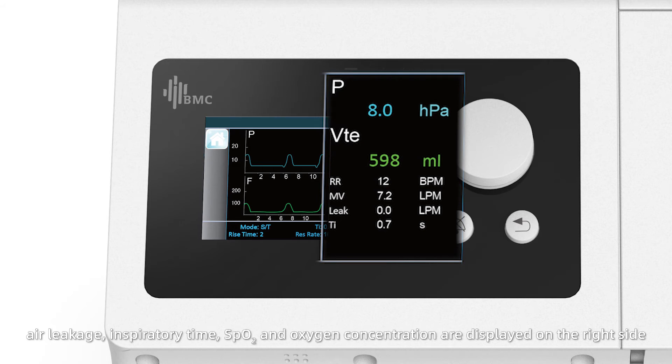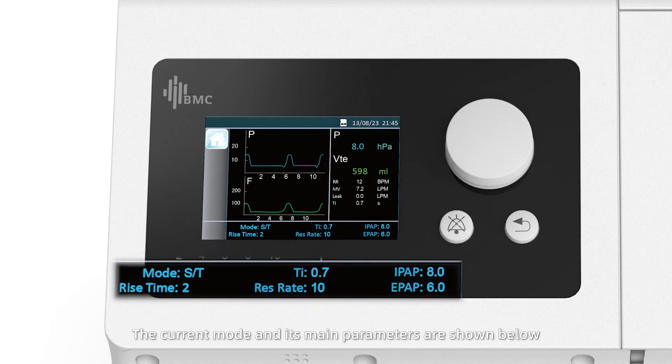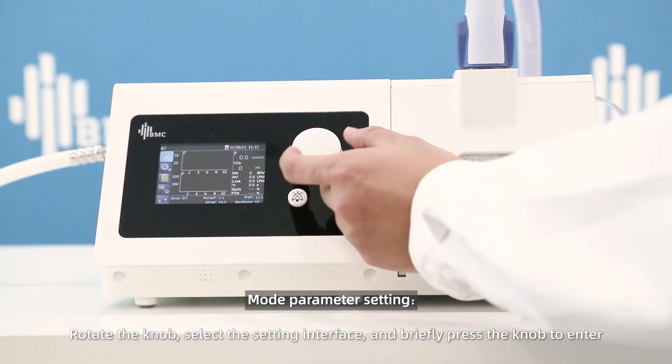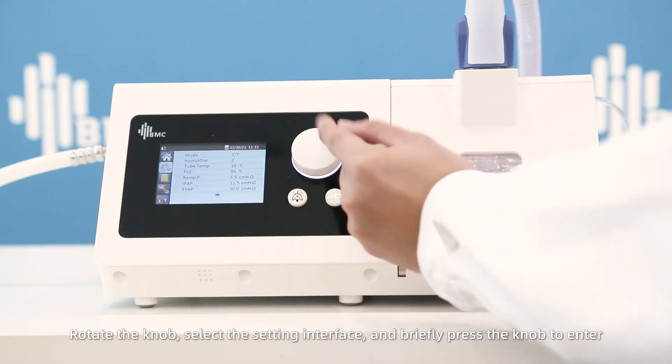Inspiratory time, SpO2, and oxygen concentration are displayed on the right side. The current mode and its main parameters are shown below. Rotate the knob to select the setting interface and briefly press the knob to enter.